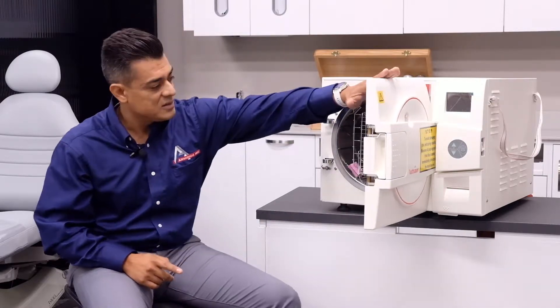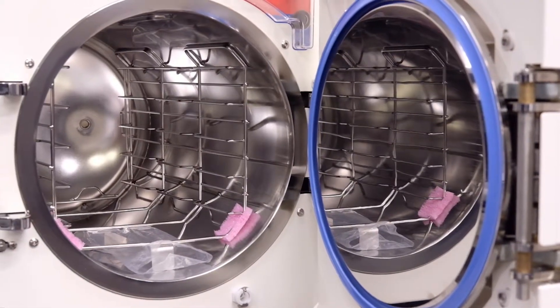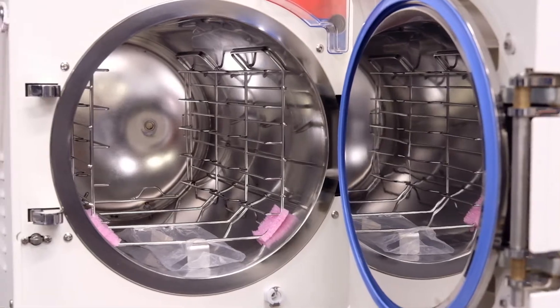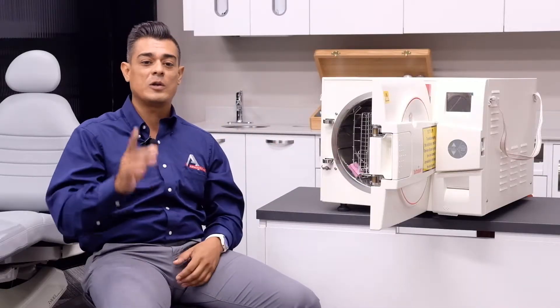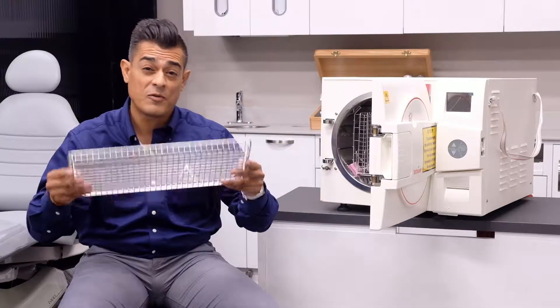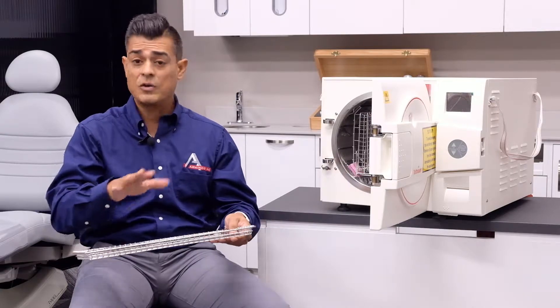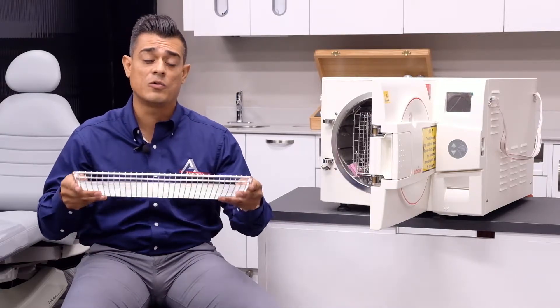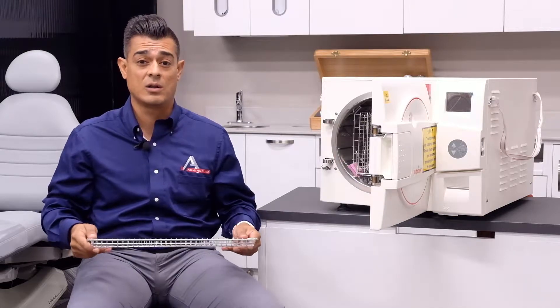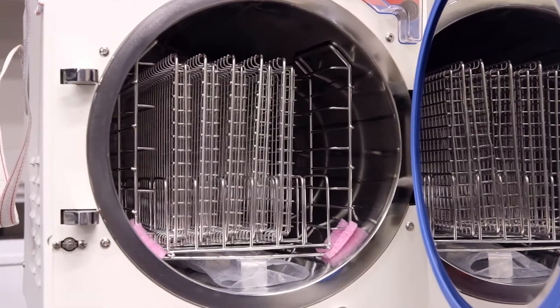A nice feature and benefit is also its chamber. It has an 11-inch by 19.8-inch deep diameter chamber with flexible loading options. You can put five full trays in there, or if you don't want to load five full trays, you can load four full trays and four half-size cassettes as well. What that means is you will never have to purchase additional trays ever again.